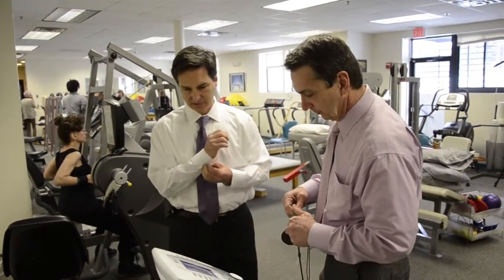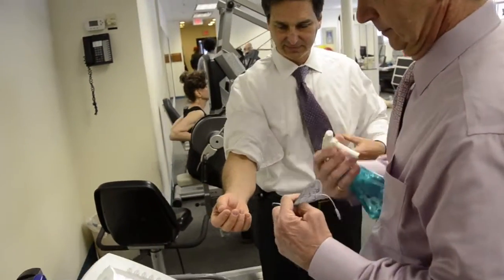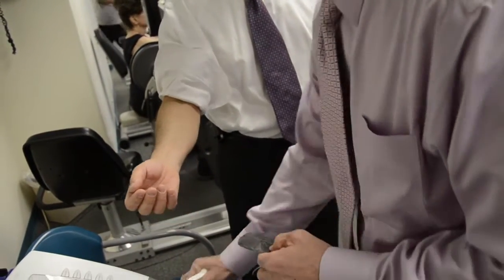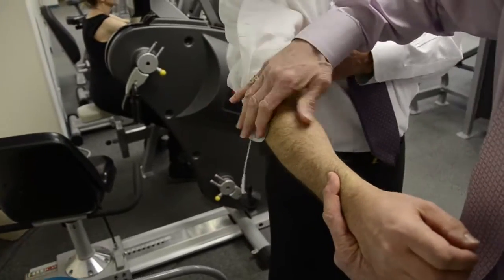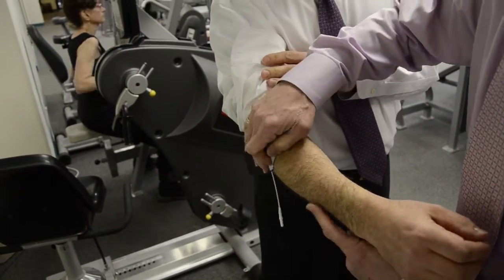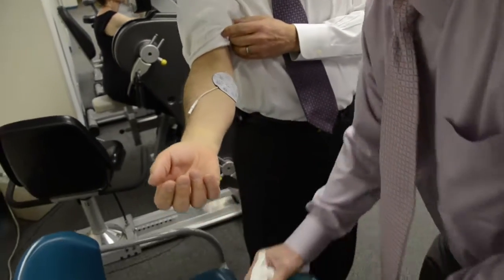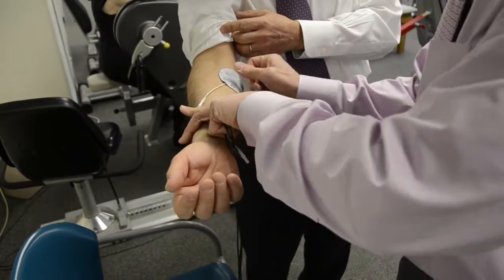So let's see what it feels like. We're going to do your extensor. It's just water — just to make it stick. Maybe we'll go here since we don't have hair there.